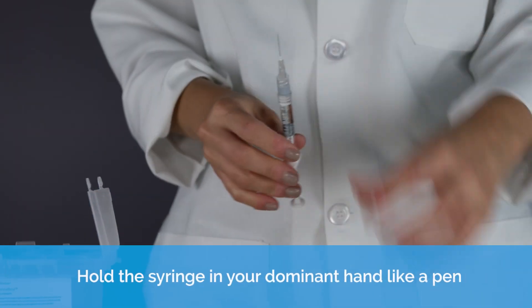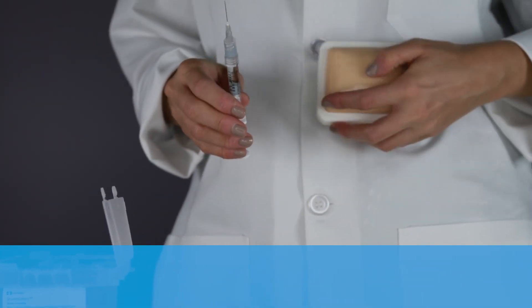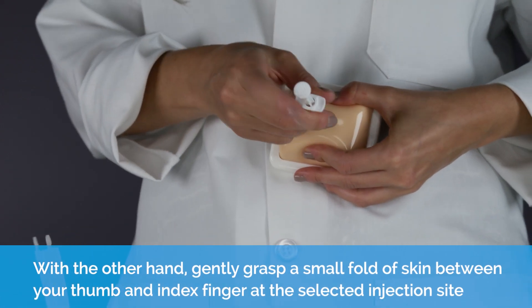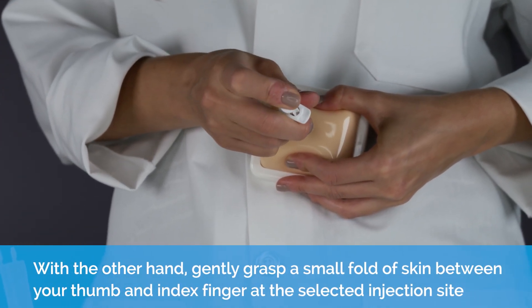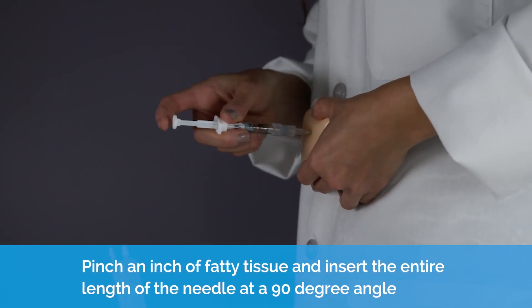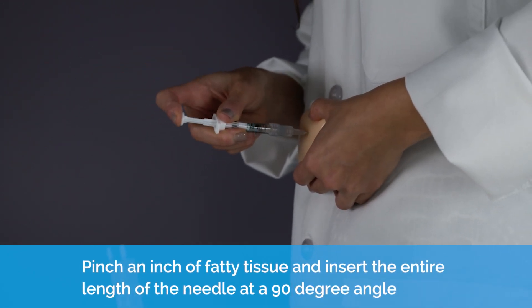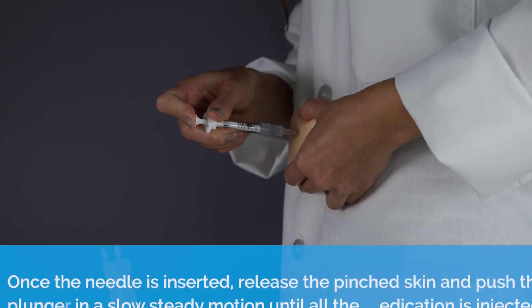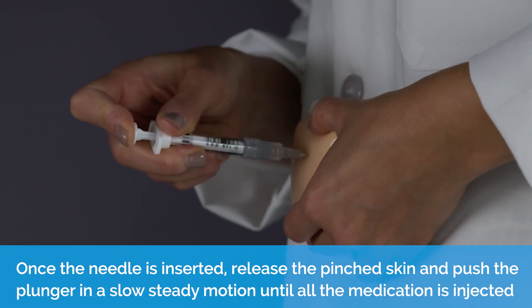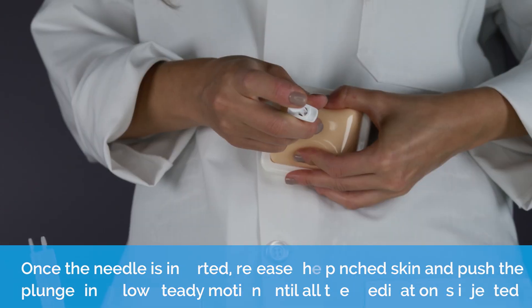Injecting. Hold the syringe in your dominant hand like a pen. With the other hand, gently grasp a small fold of skin between your thumb and index finger at the selected injection site. Pinch an inch of fatty tissue and insert the entire length of the needle at a 90 degree angle. Once the needle is inserted, release the pinched skin and push the plunger in a slow, steady motion until all of the medication is injected.